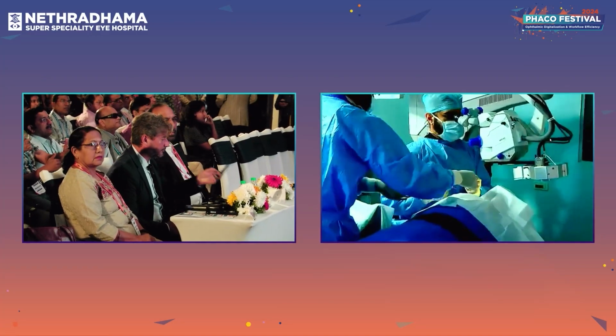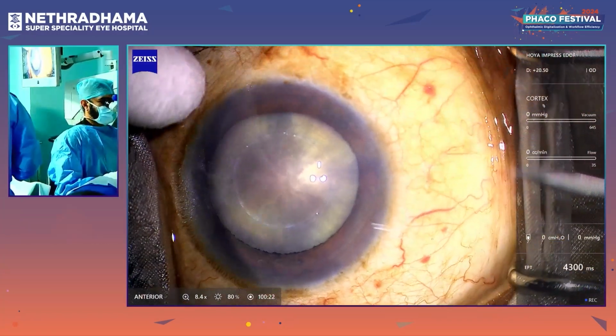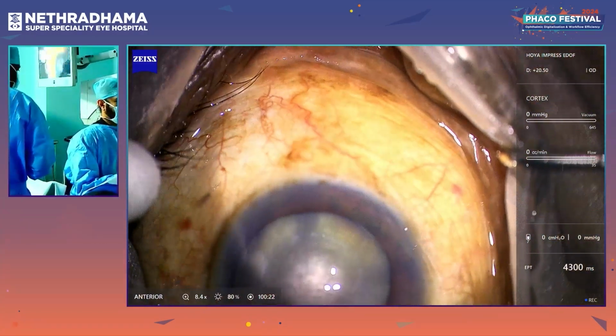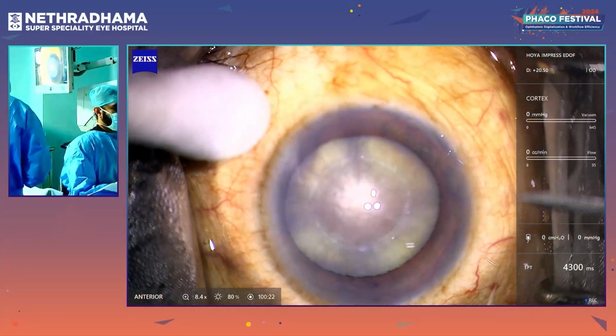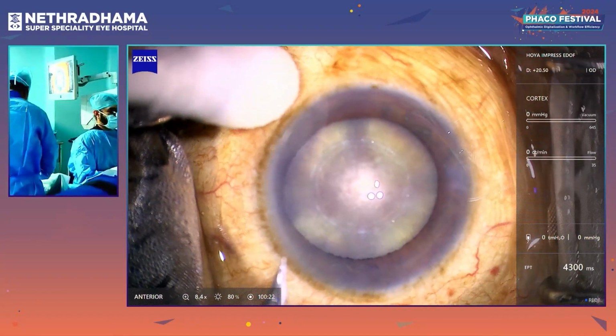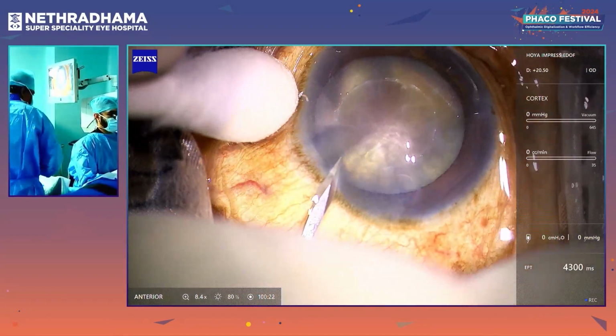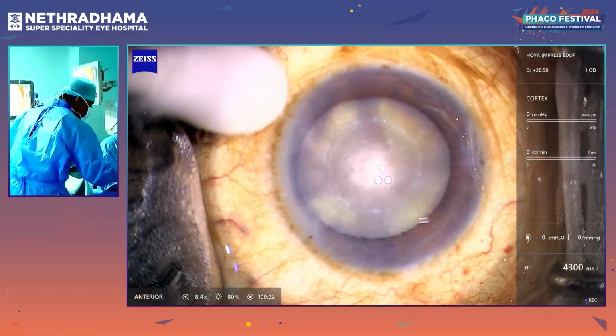So for this case, we have just done only... Look down, sir, not the head, just the eyes. Correct. Look at the light, sir. So this is one of the issues you can have in these kinds of cataracts, where the patients are unable to follow the light, but nothing to worry. Now, main port.